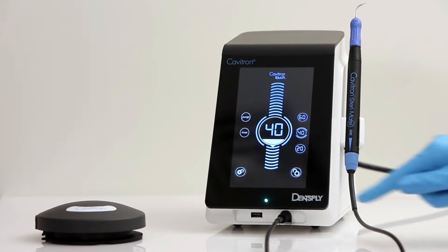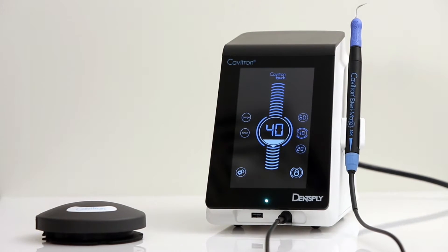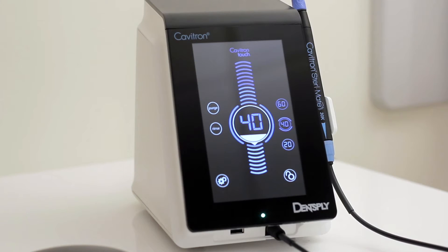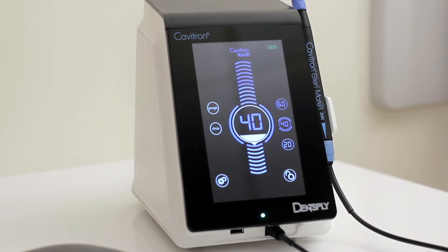The lock icon is pressed and held for 2 seconds to lock the screen, disabling adjustment of any parameter until the icon is pressed and held for 2 seconds. The upper right corner displays the battery level of the foot pedal. All of these features are detailed in the directions for use and additional videos.